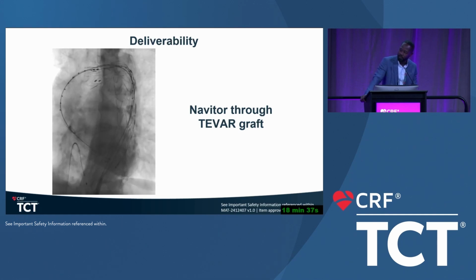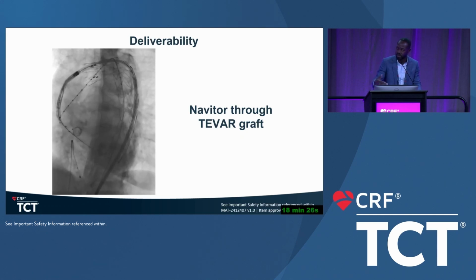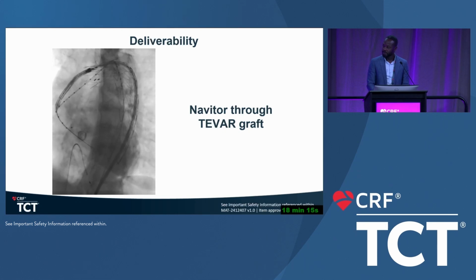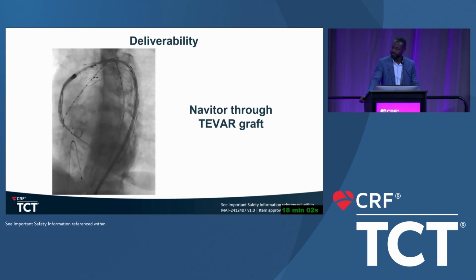So Azeem, in your experience, what is the proportion of the patients that you redirect to surgery if you have a lot of tortuosities, or are you happy with the devices that we have, such as the Navitor? Yeah, so I must admit, for tortuosity, it's very rare that I will send a patient to surgery. If I have to look at the patients I send to surgery, maybe this is the top 3 reasons, right? The one is bicuspids in young patients, especially if they have aortopathy, they all go to surgeons. Patients with really bad coronary disease, high SYNTAX scores, who I think are going to benefit from having a LIMA on the LAD, I send to surgeons.